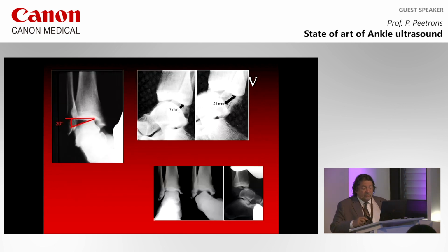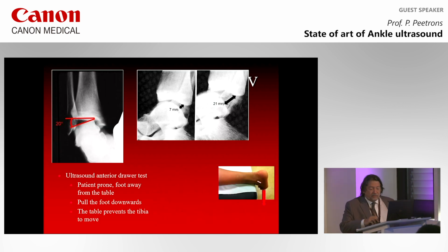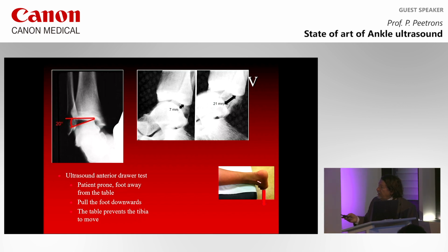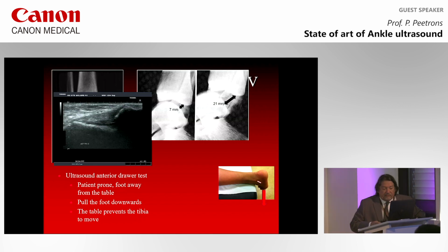This is how we do this image in radiography, of course, or this one. You can see that the talus is going forward towards the fibula and the tibia, of course, but in ultrasound we are looking at the fibula. So what we do in ultrasound is put the patient prone and put his tibia on the table. So the table is doing what your hand is doing on the tibia in X-rays. And then we pull the foot downwards, and the table prevents the tibia from moving, and we see the movements of the ATFL, and we see the movements of the fibula and the talus.